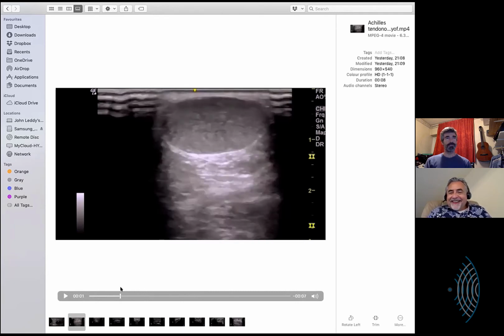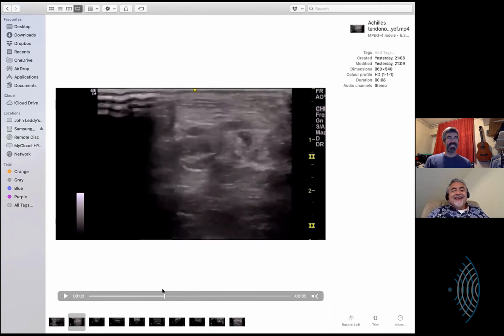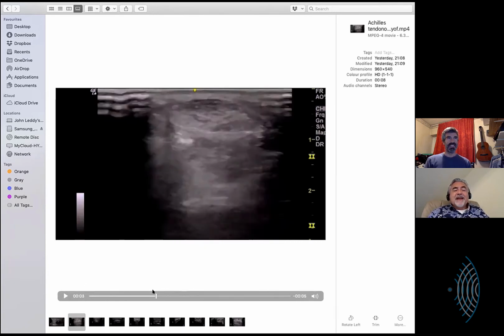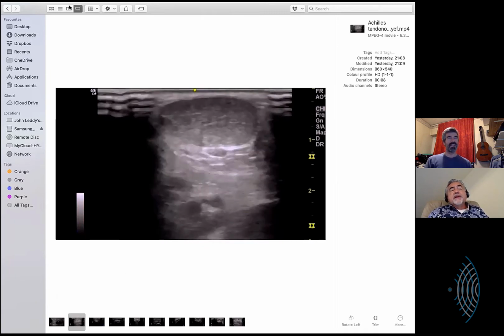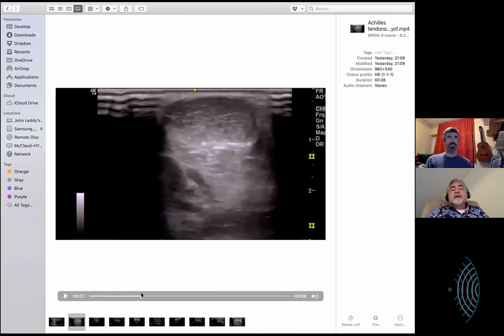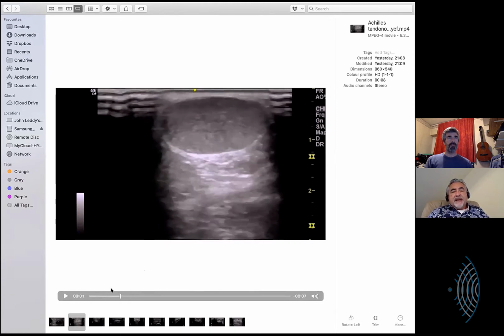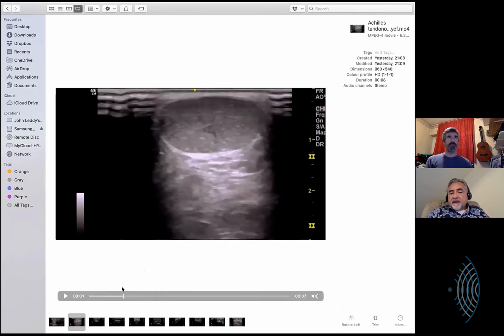Nope. Was that right? Wow, that's amazing stuff. Now, the next question I have for you on this too is: would you be able to say that in the longitudinal view or long axis view that would be soleus fibers? Would you be able to say it does look as though it's specific to the soleus, or is it hard to say that?